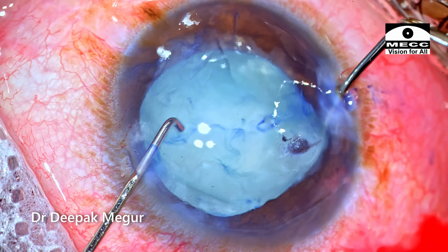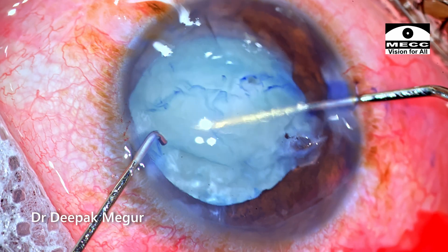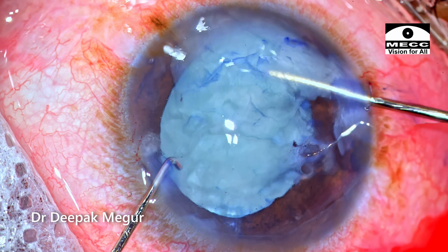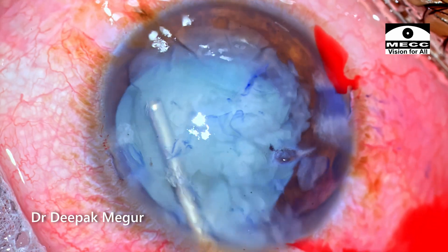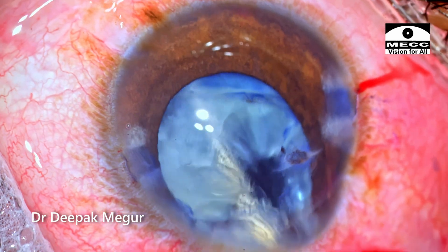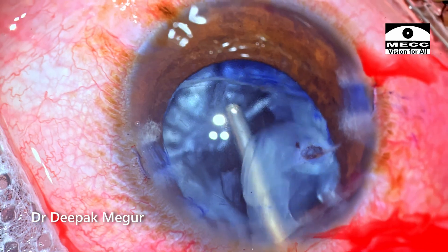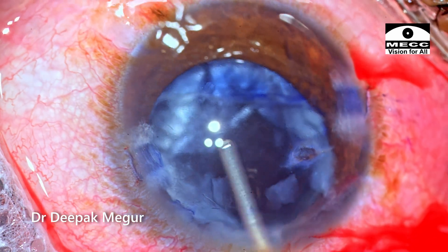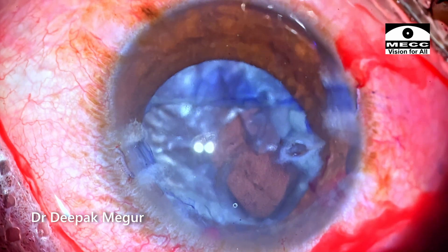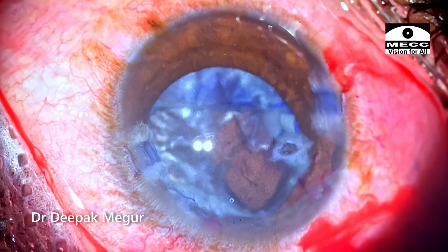With the Sinskey hook, the soft lens matter is manipulated out of the bag and then it is expressed out with viscoelastic. Now, with retro-illumination, the visibility is a bit better.